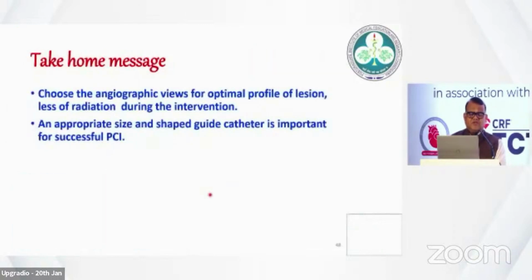So take home message, choose the angiographic view for optimal profile of lesion prior to PCI and at the time of PCI as well. Mind that any extreme caudal or cranial view do have more scattered radiation. So avoid this type of view more frequently and for prolonged duration during the PCI.